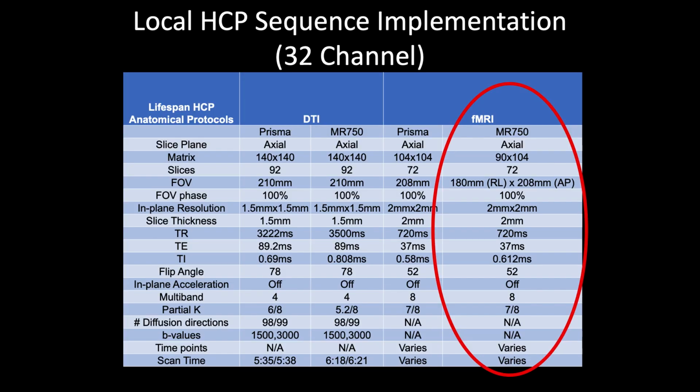Now, the HCP put together their protocol based on the Siemens scanners, specifically for the Prisma. And we're fortunate that we have been able to replicate their parameters here.